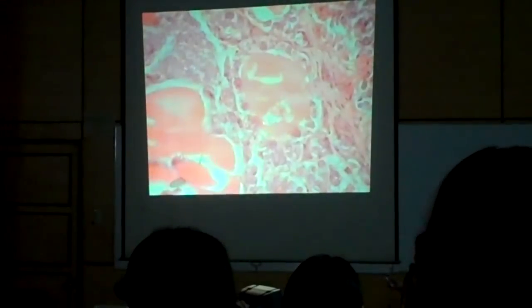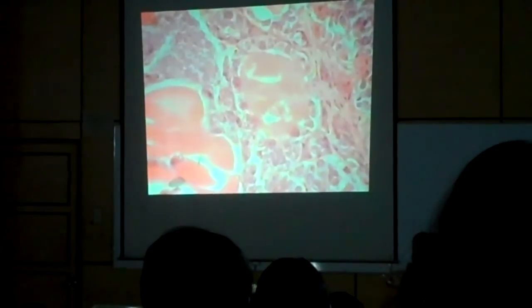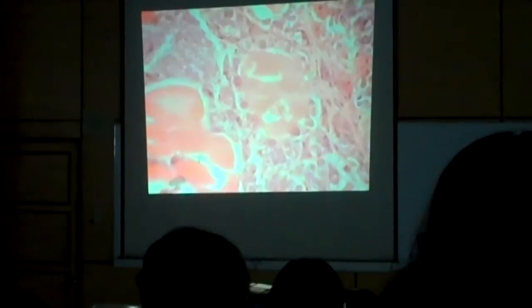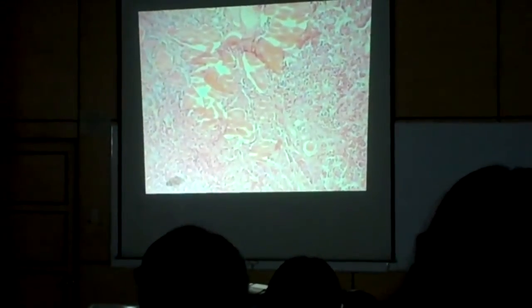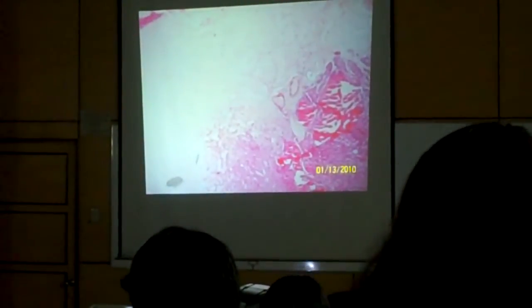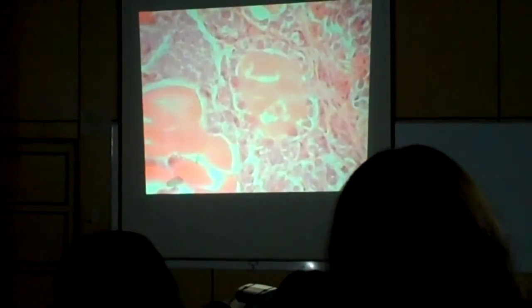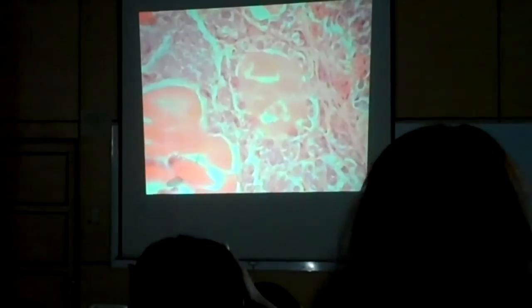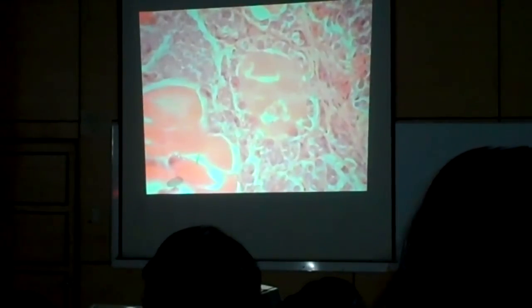If you look closely, they are lined by cuboidal to low columnar cells. But again, if we ask you to identify the Rathke's pouch, it will be in this magnification, not the close-up or high power. If you only see this, you might mistake it for thyroid.